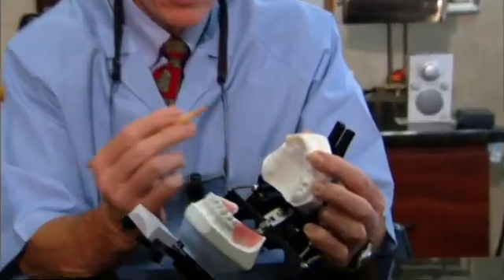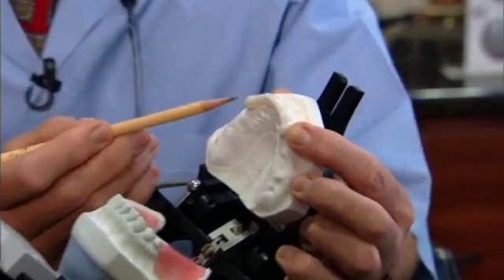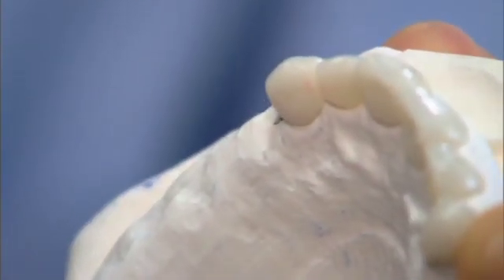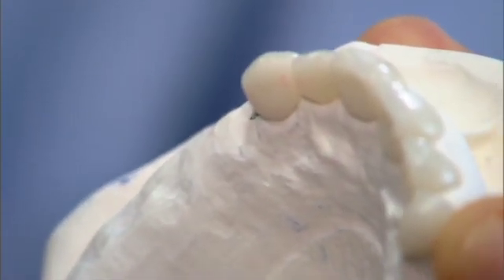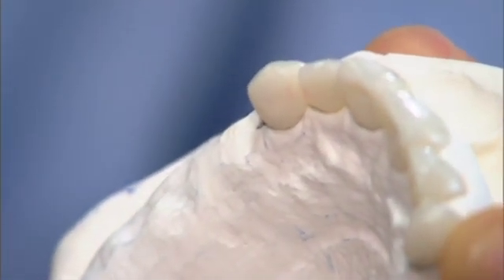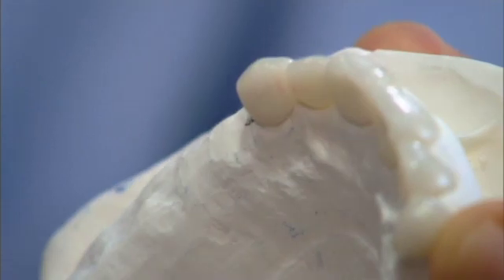What a wonderful thing to know at the time I'm doing my surgery, because what I'm planning to do is take a little distal wedge of tissue off behind 6 and 11, which will give much more room for the technicians to work to bring our major connector in, our minor connector over the top of the implant.